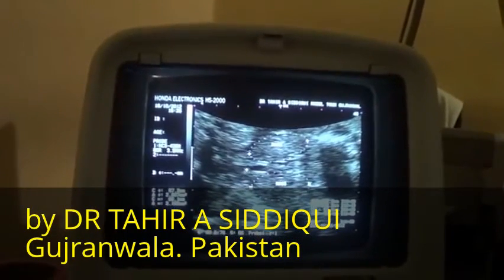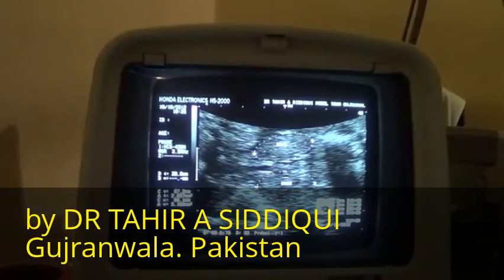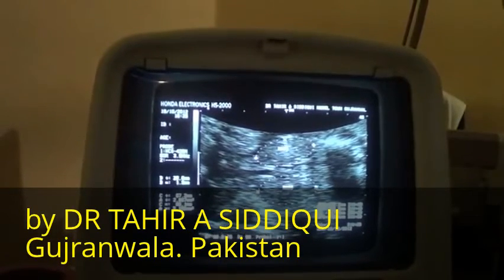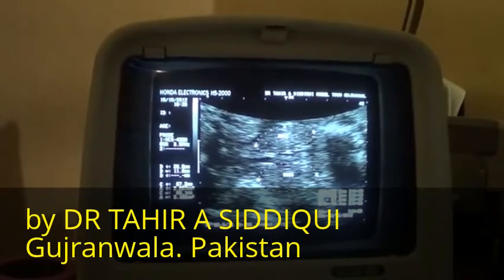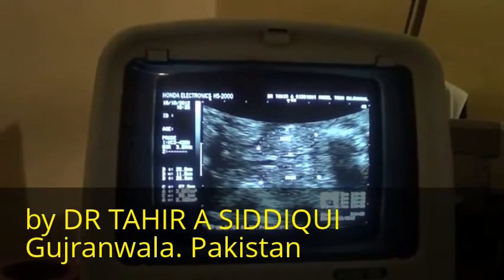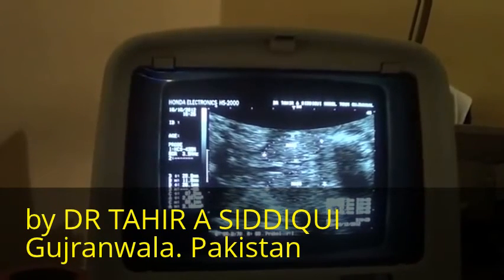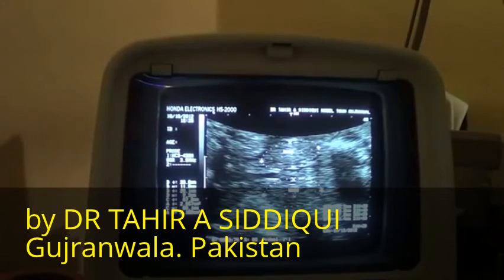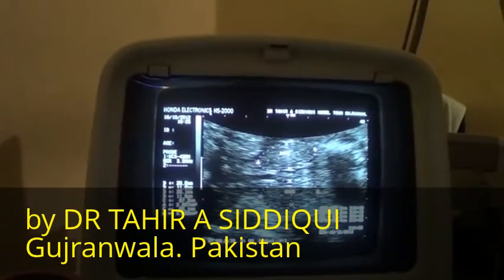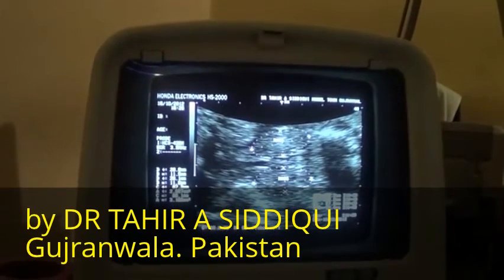In this location, if you measure the lobes separately, the measurements in longitudinal section, both measure 2.8 centimeter. In anterior posterior diameter, both measure approximately 11.8 millimeter.